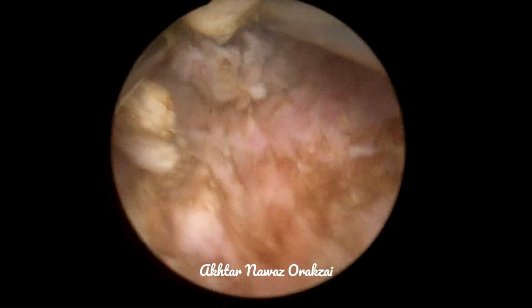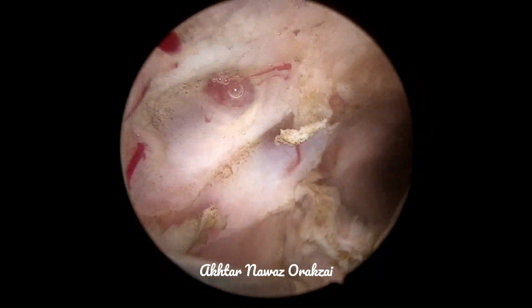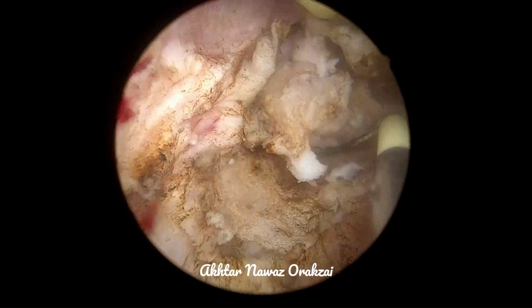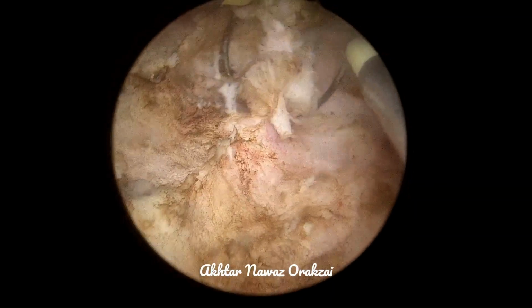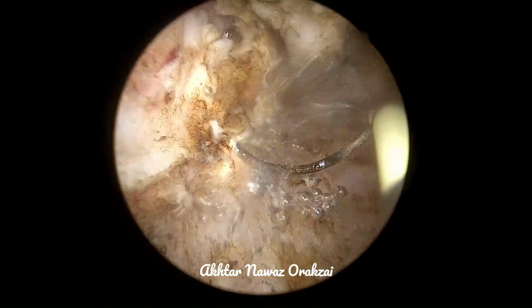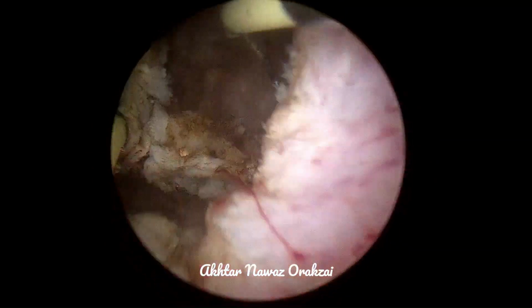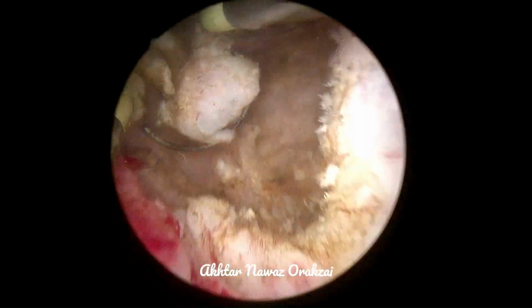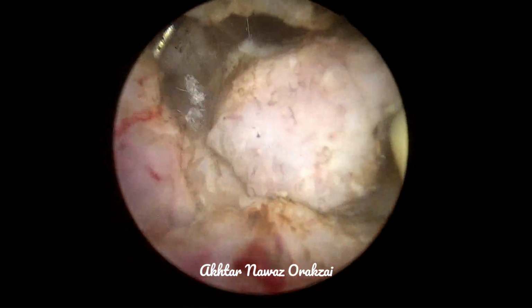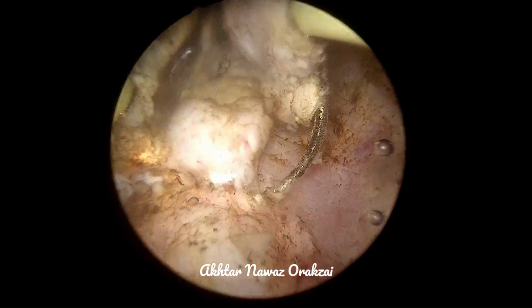Always remember, over resection is never good. If it is under resected, and the patient is not symptomatically relieved, you can do another session of TURP after some time, but an over resection leading to complications cannot be reversed.